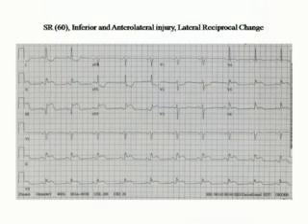And if you look in lead 1 and AVL and V2, I have the appearance of ST segment depression. Now these leads may actually just be seeing what's going on down here from the other side of the heart, or there may be true subendocardial injury. You can't look at the shape of this and tell the difference. So I'd call it lateral subendocardial injury, or reciprocal change, which is what it's referred to when you're seeing the mirror image from the other side of the heart.